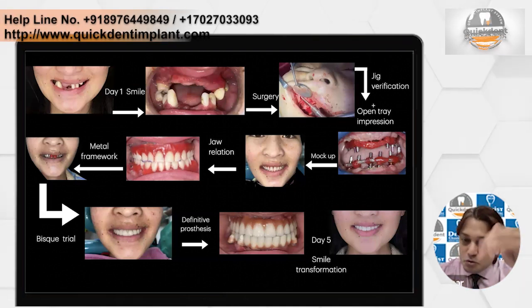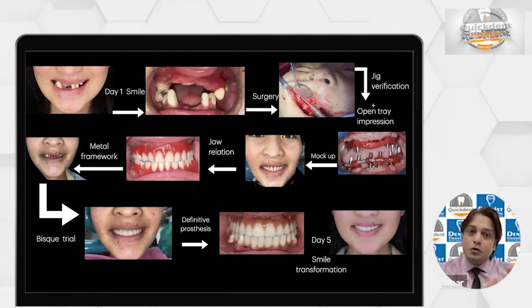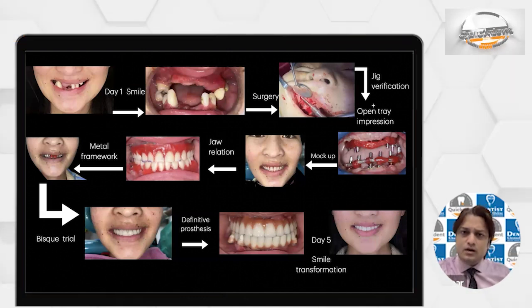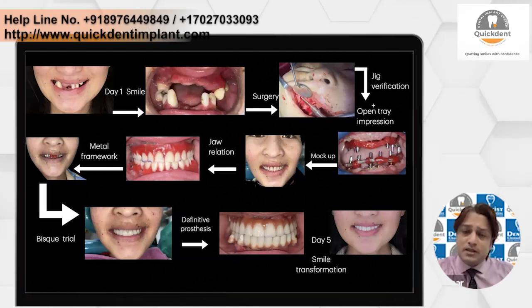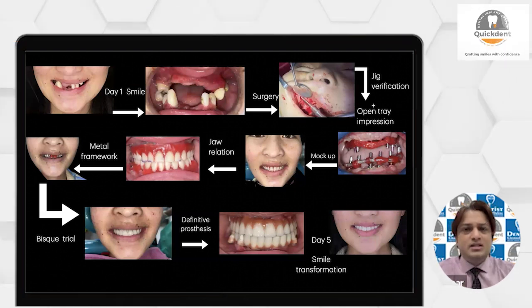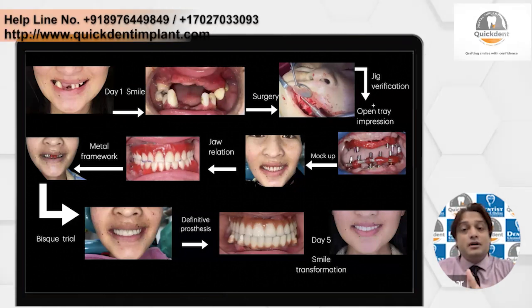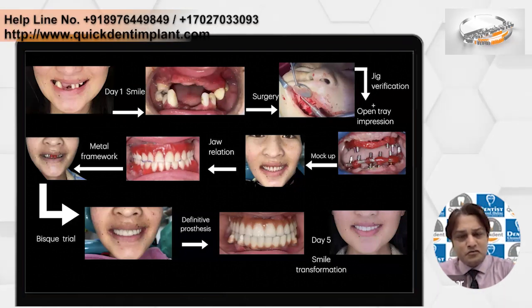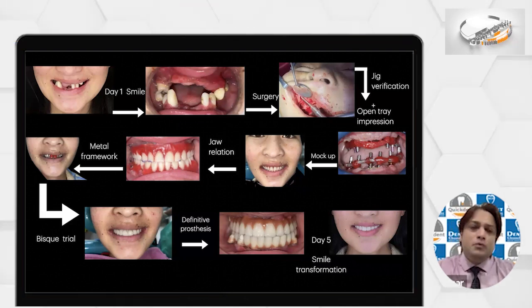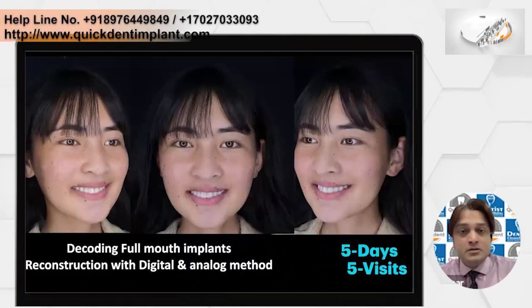Today in this webinar I will be emphasizing how you can do the transformation prosthetically or surgically, with a digital method as well as an analog method. The analog method is the conventional method where digital components are rarely used. The digital method is where nowadays you will see a lot of digital things happening. I'll show you both methods, compare them, and we'll come to a conclusion about which is best, or which is not.